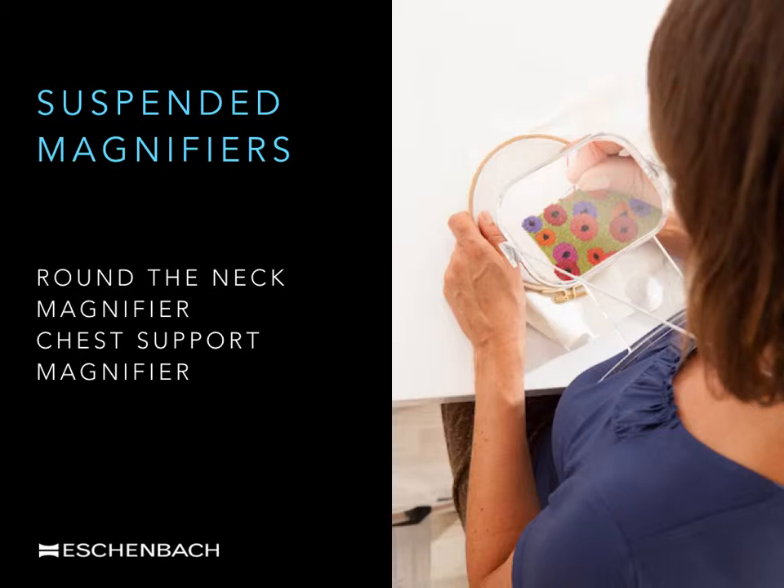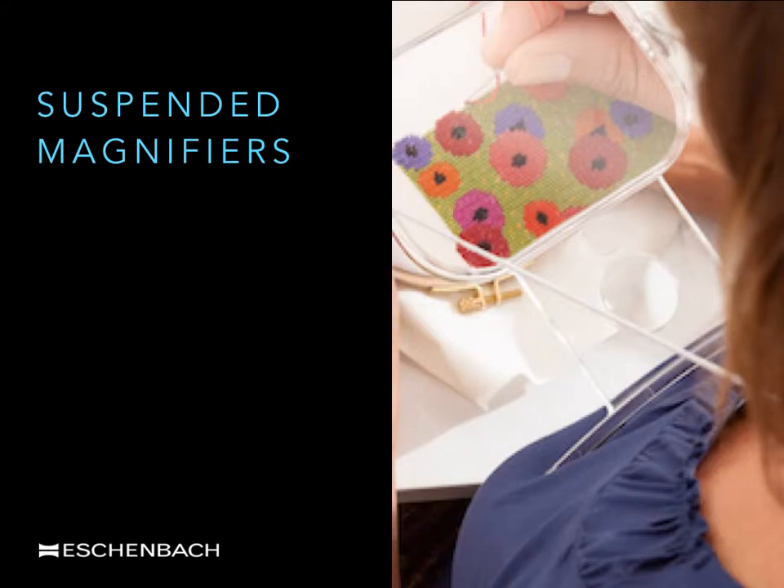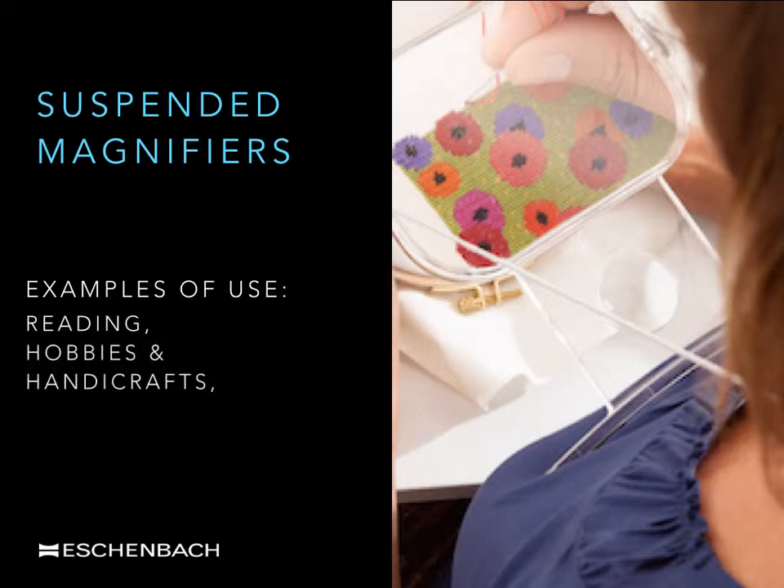Although there is only two times magnification in the main lens, the user benefits from the large lens diameter which offers a large field of view. When additional magnification is needed, there is a smaller four times lens insert available in the stem. This type of magnifier is particularly popular with those needing a hands-free solution for either reading or hobbies and handicrafts, as shown in the photograph.